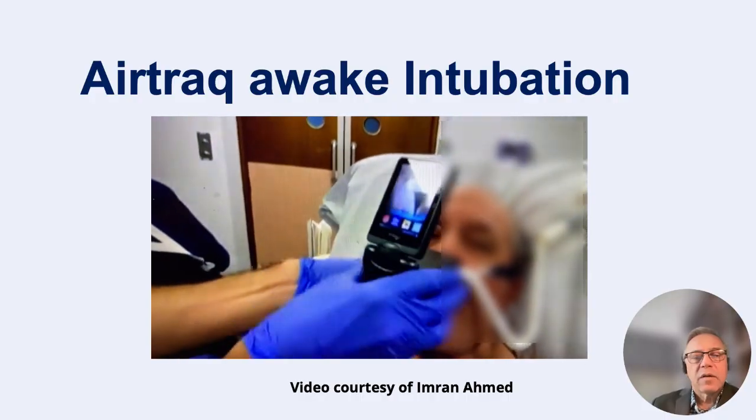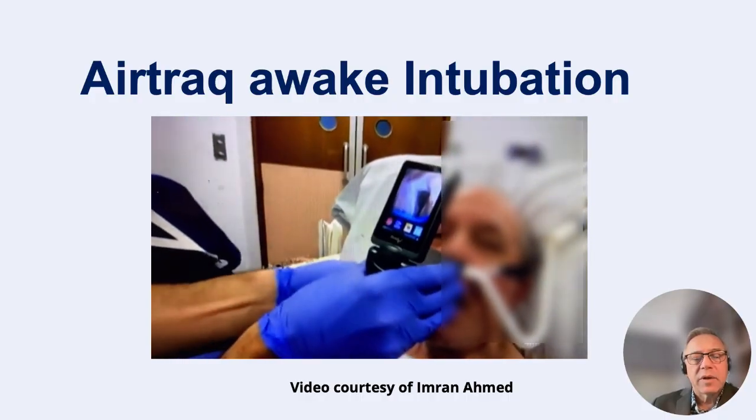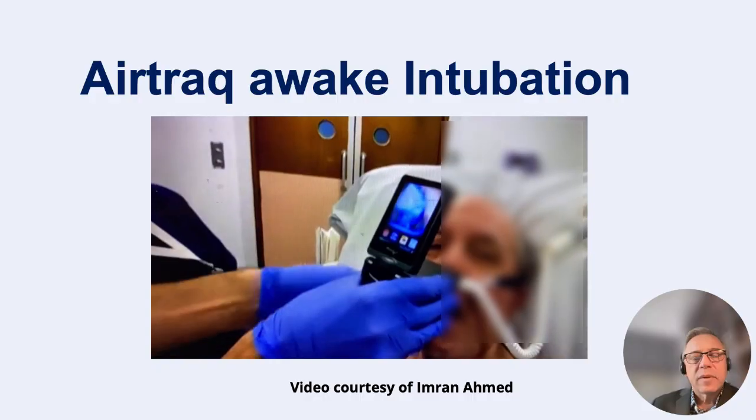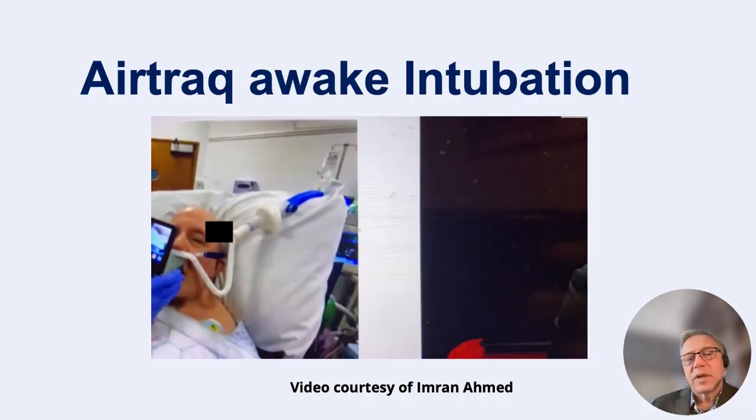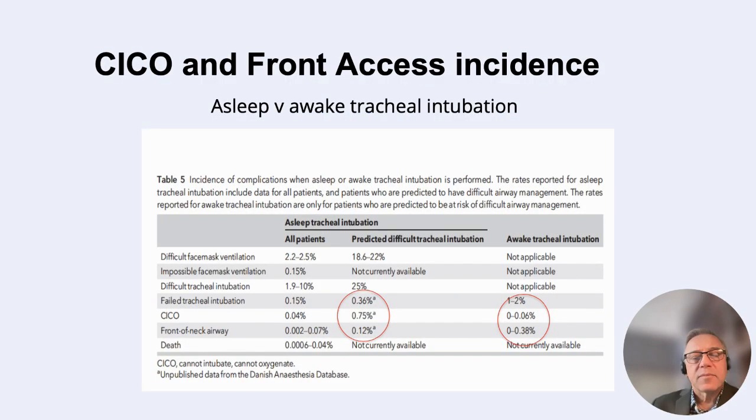by a colleague of mine in London, Imran Ahmed. This is using AirTraq. Patient is sedated, breathing spontaneously, easy, seconds.